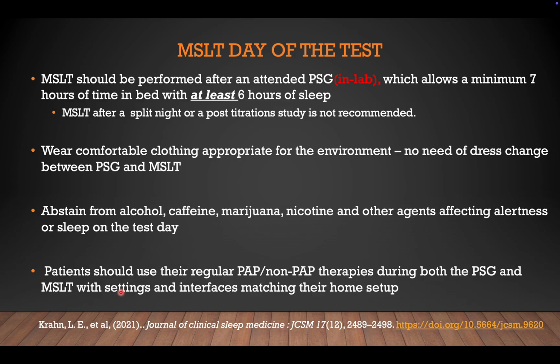So now we are talking about the adult sleep MSLT. Okay, the MSLT after a split-night or a post-titration study is not recommended. Wear comfortable clothing appropriate for the environment. There was a previous MSLT/MWT recommendation that the patient needs to change into street clothes, but it's no longer required.